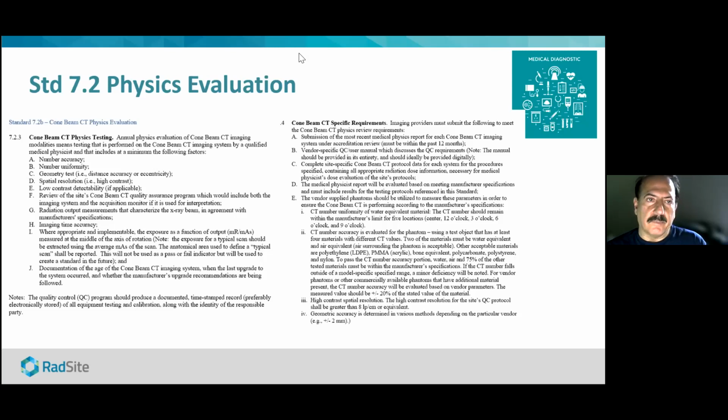And then we also have standards that address parameters that would cut across multiple different cone beam CT scanners. So one would be able to look at how to measure dose across multiple scanners and how to look at quality across multiple scanners. But at this point, the basic question is meeting the manufacturer's own requirements for the testing that the manufacturer has, at the frequency that is required by the manufacturer.